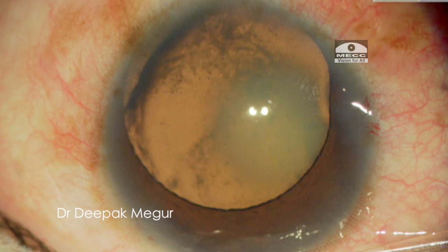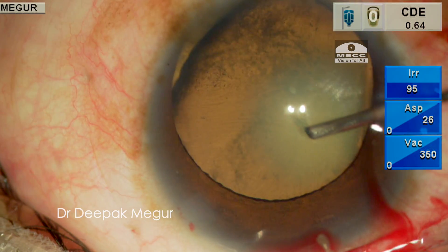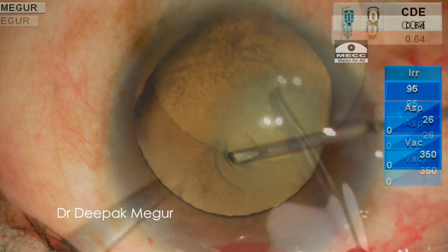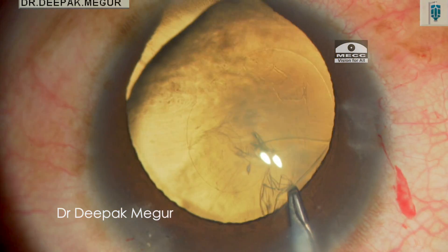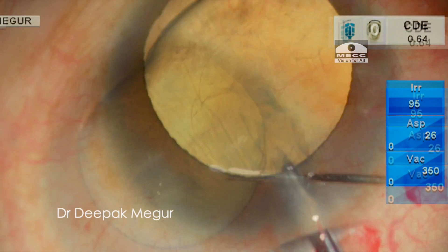One of the most critical steps in such eyes is to get a perfectly centered and perfectly sized rhexis. The key thing here is to ensure that the rhexis is centered on the lens rather than being centered on the pupil. After the initial puncture, I'm using Dr. Haldipukar's forceps to perform the rhexis, which is decently sized and after completing it looks quite all right.